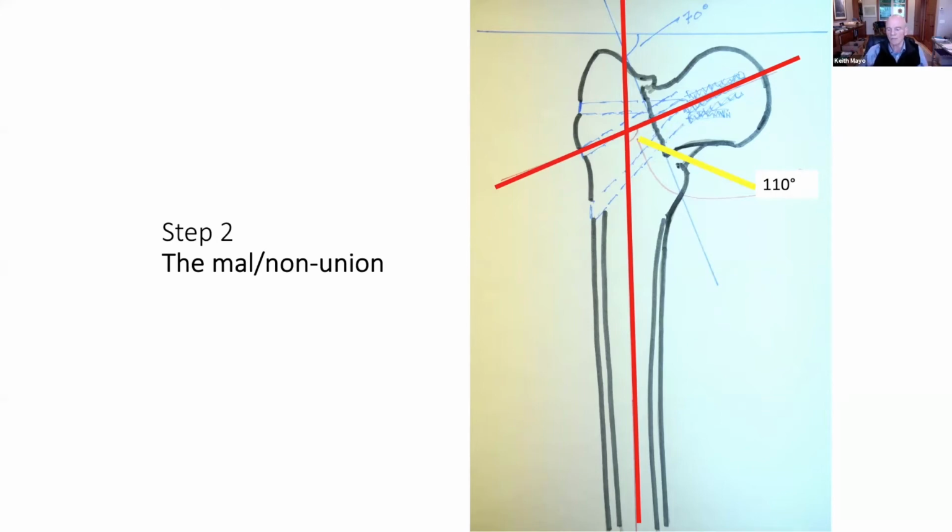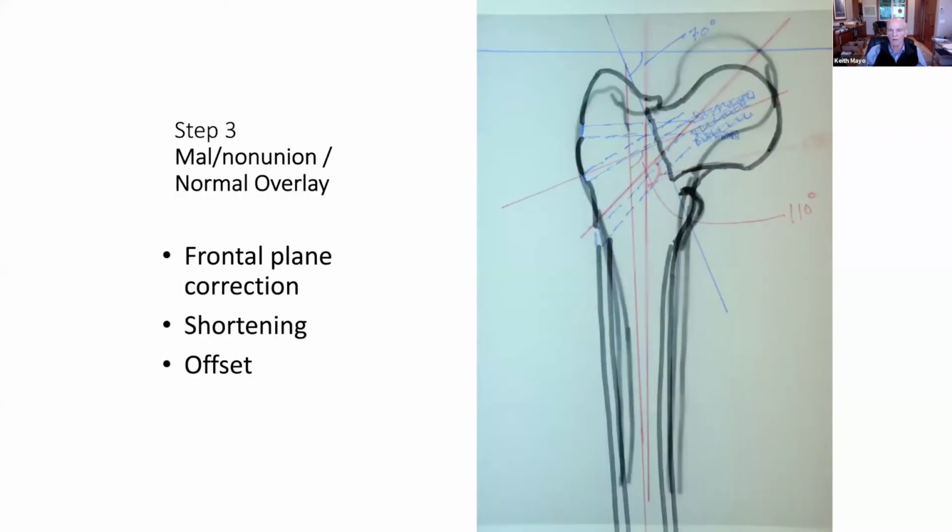So that makes it difficult because none of our blades are at 5-degree increments, and the easiest osteotomy to set up is one in which the blade insertion is orthogonal to the longitudinal axis of the femur. And so I arbitrarily, in situations like this, will usually default to the next size higher angle. So slightly more valgus is acceptable. A lot more valgus is not. So 25 degrees difference. And now we're going to do an overlay.